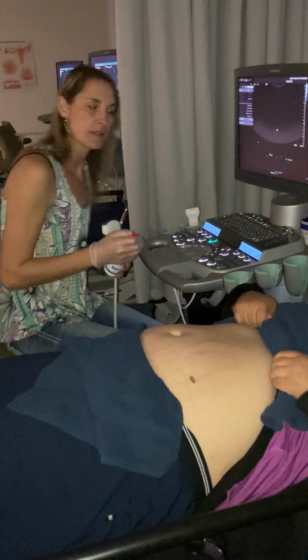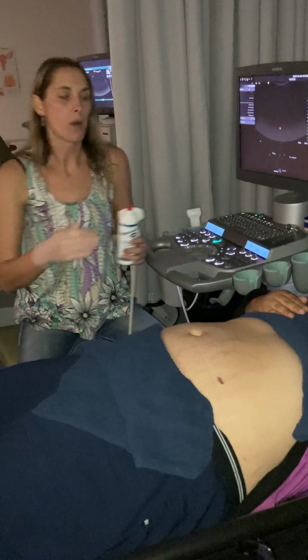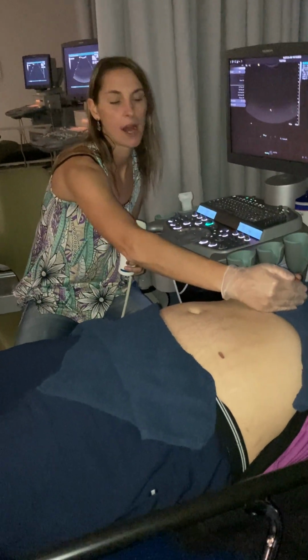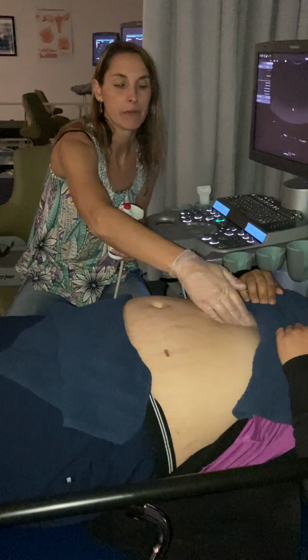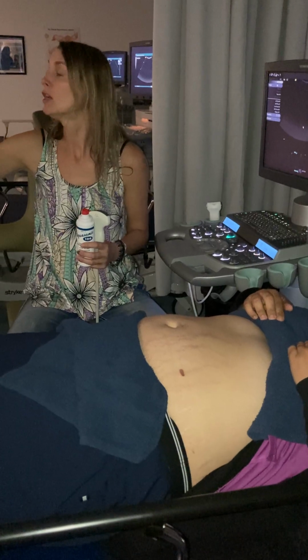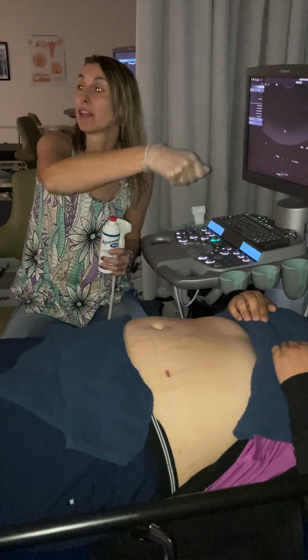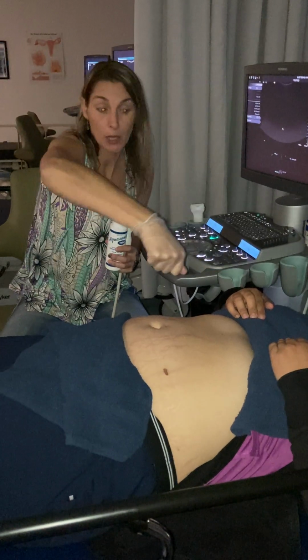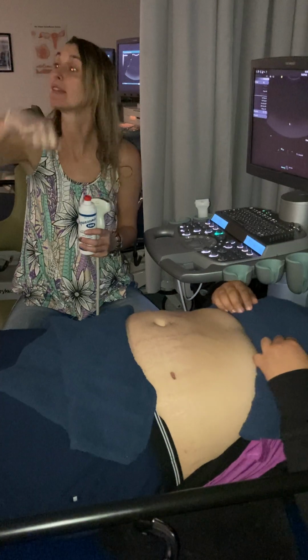So for prox, you're gonna forget this eventually. What we want to do for prox is we actually want to be really high on the sternum and get it through that liver. If you go subxiphoid, which isn't the end of the world on some patients, that's when you're going to get that angle. So we're going to be really high up on that sternum. When we do liver, you're going to stay on that sternum. I'm going to say, no, we got to go below and push and scoop. So it's kind of two different windows in the same area.